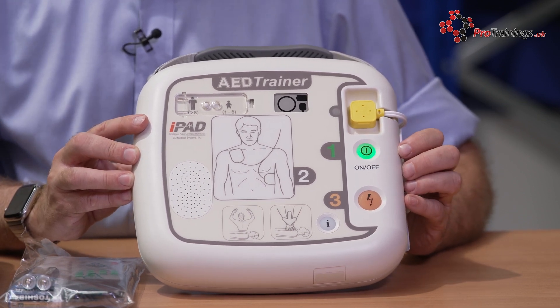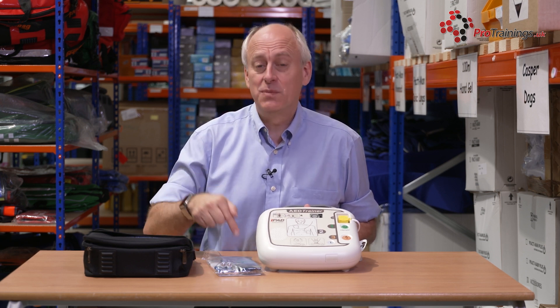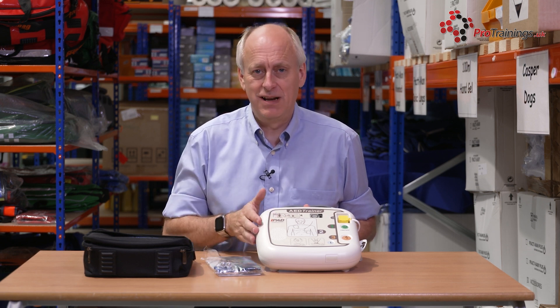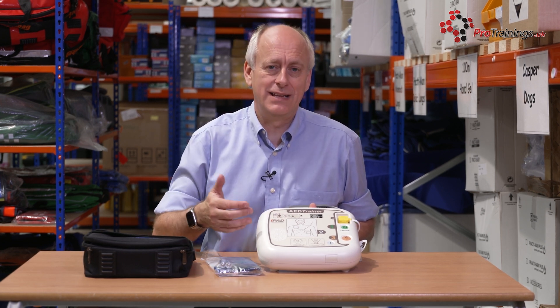You control things through the remote control — there are about 10 scenarios on it, depending on whether you want it to advise shock or no shock. You can pre-program those and set it up beforehand so each student gets a different scenario, or you can do a basic scenario to start with and then change to more advanced settings as time goes on.